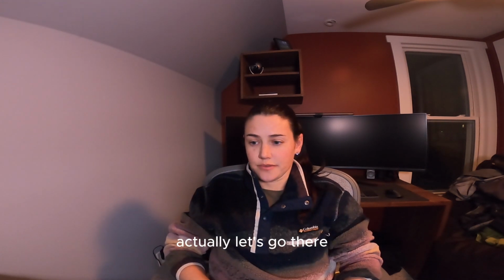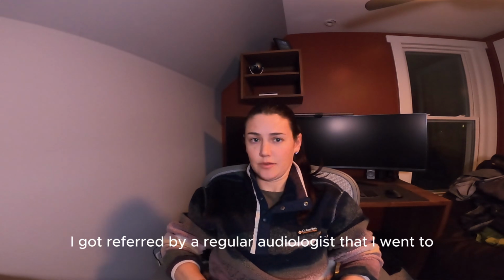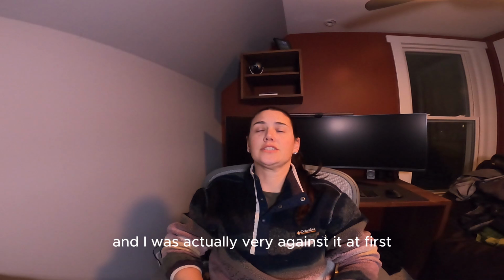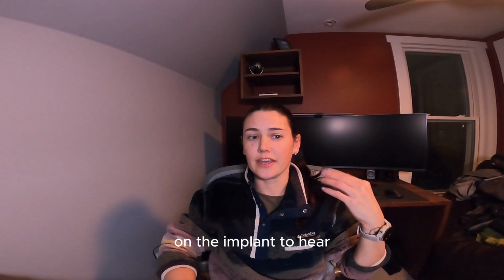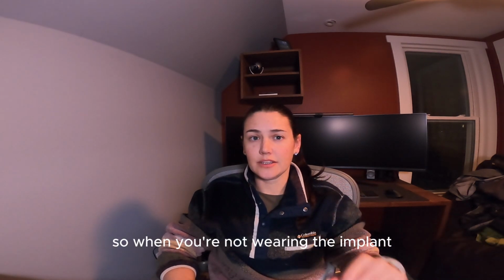Actually, let's go there. So I got referred by a regular audiologist that I went to that said, I think you're a good candidate for the implant. And I was actually very against it at first. I didn't want it because you also become dependent on the implant to hear. So when you're not wearing the implant, you basically are completely deaf in that ear.